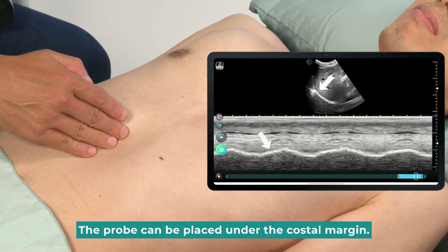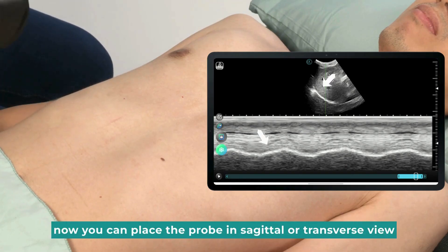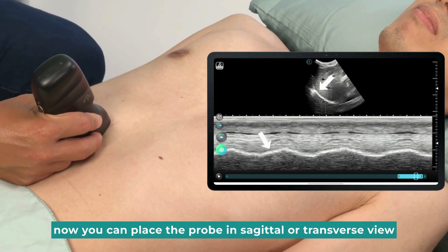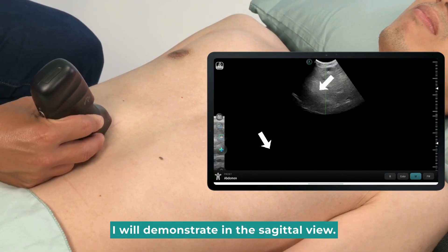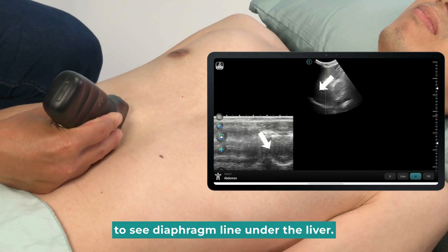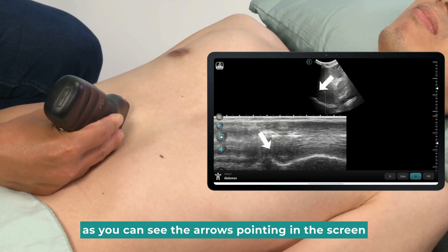The probe can be placed under the costal margin, as you can see in the M mode on the screen. You can place the probe either in sagittal or in the transverse view. For this demonstration, I will demo in the sagittal view. You can scan right, left, and tilt the probe to see the diaphragm line under the liver, as you can see the arrows pointing on the screen.